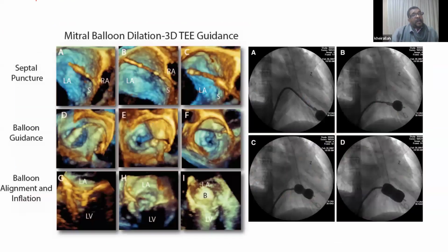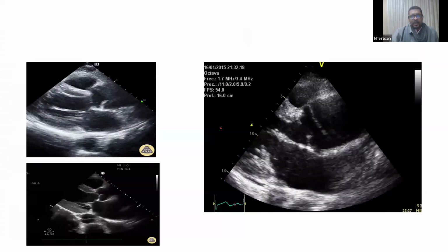As for mitral ballooning, again, it's better to be done by TEE guided because we show them the septal puncture and the inflation, and then how the valve is split in the commissure, if there is MR, new appearing MR, how the gradients drop after, how the area changes before and after ballooning. So TEE guidance is also important here.